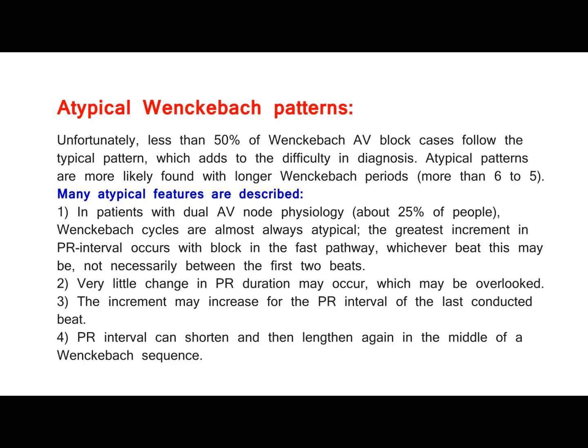2. Very little change in PR duration may occur, which may be overlooked. 3. The increment may increase for the PR interval of the last conducted beat. 4. PR interval can shorten and then lengthen again in the middle of a Wenckebach sequence.